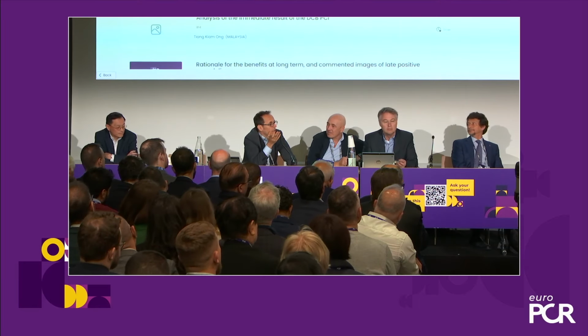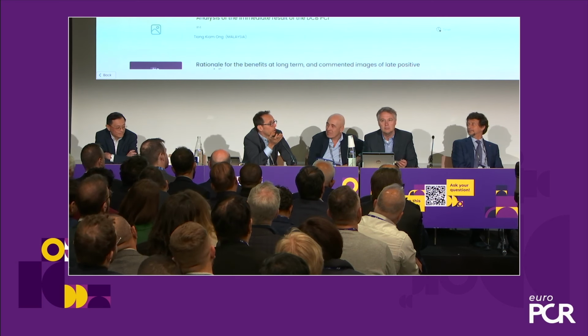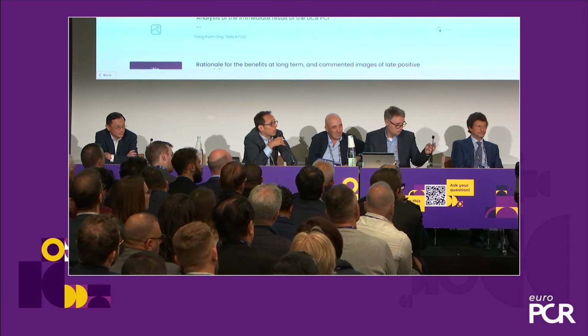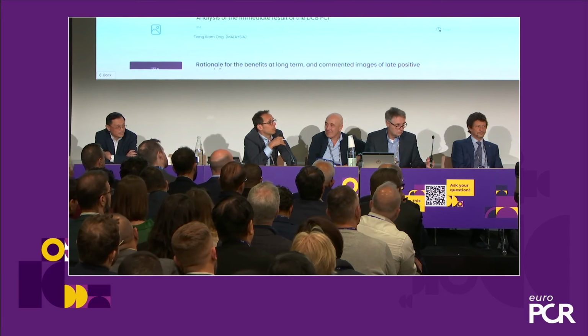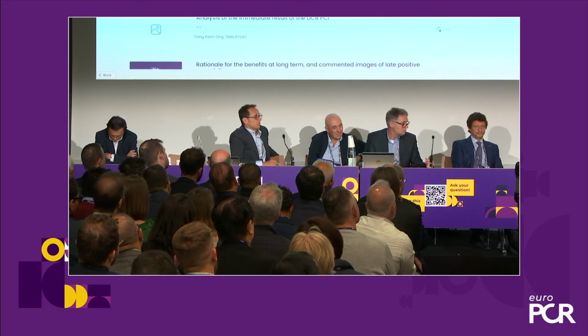We don't have data, as far as I know, relating imaging to a good DCB result. But you do know you want to pre-treat. Sure. If you have a calcified lesion, it's absolutely essential to do a good plaque prep. Agree. Yeah.